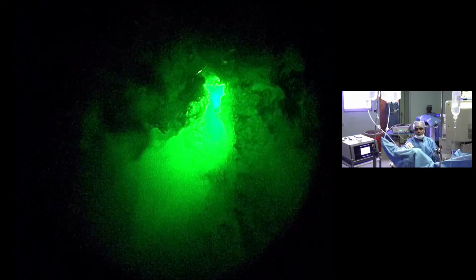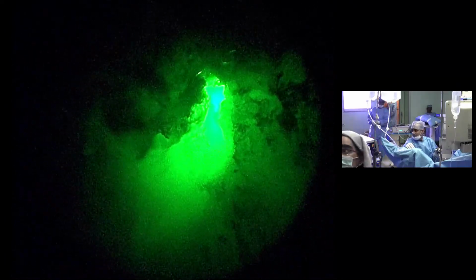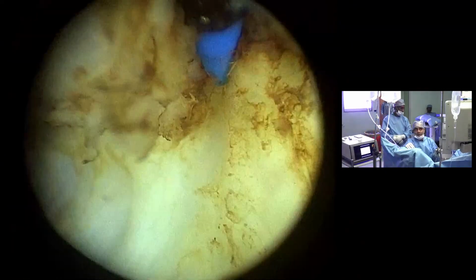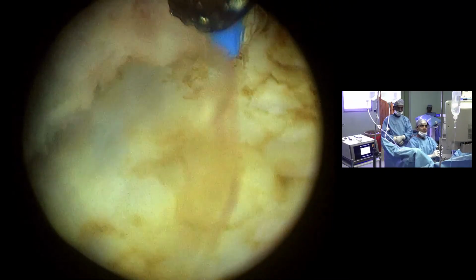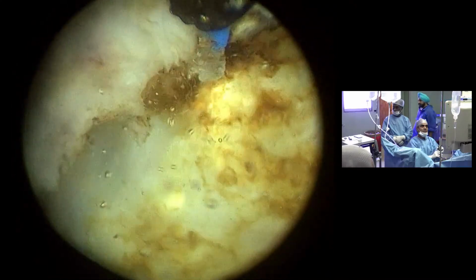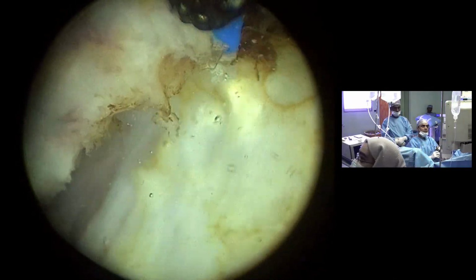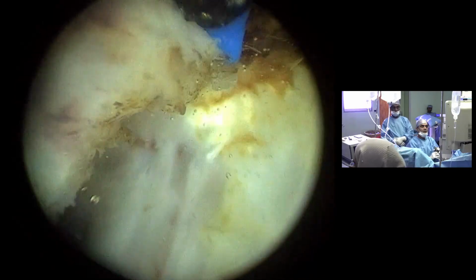Dr. Ashish, so there is no light. Hello? Actually, the light source has stopped. Yes, sir. Actually, we are just fixing the light from the light source. Yes, Ashish sir. Yeah, your beam. Actually, we were just fixing the light now. The light source was off. Now you can see. Right. Okay. Because we were getting a very bright beam, that's why. Okay.